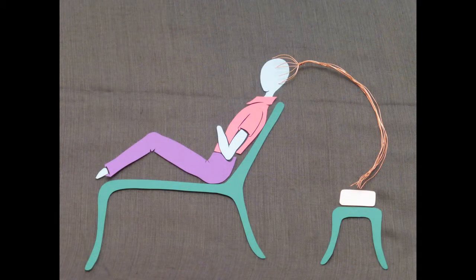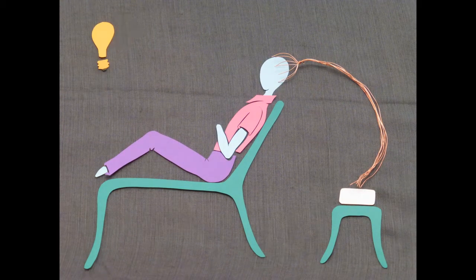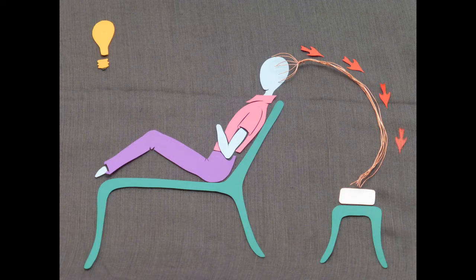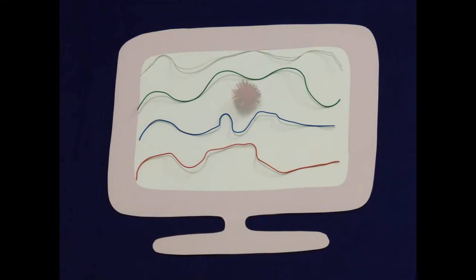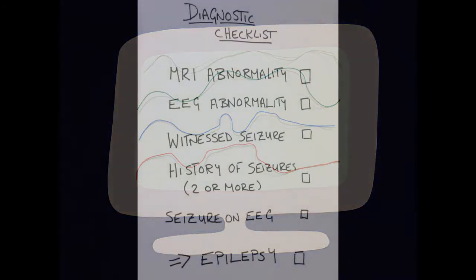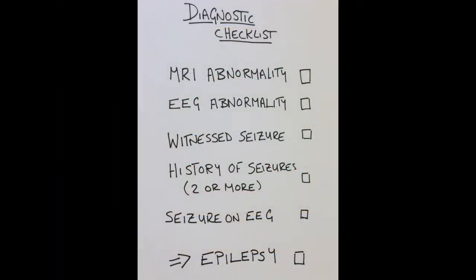Usually there'd be a period of hyperventilation, so getting the person to breathe in and out very vigorously for a few minutes. And often we use rapidly flashing lights, so-called photic stimulation, to see if that produces any abnormalities on the EEG. And what we're looking for on the EEG is some very typical abnormalities where there are very brief bursts of abnormal electrical activity that typically don't give rise to any symptoms, so the person wouldn't know that they're occurring. They're a very strong indicator that that person's brain is capable of generating seizures.